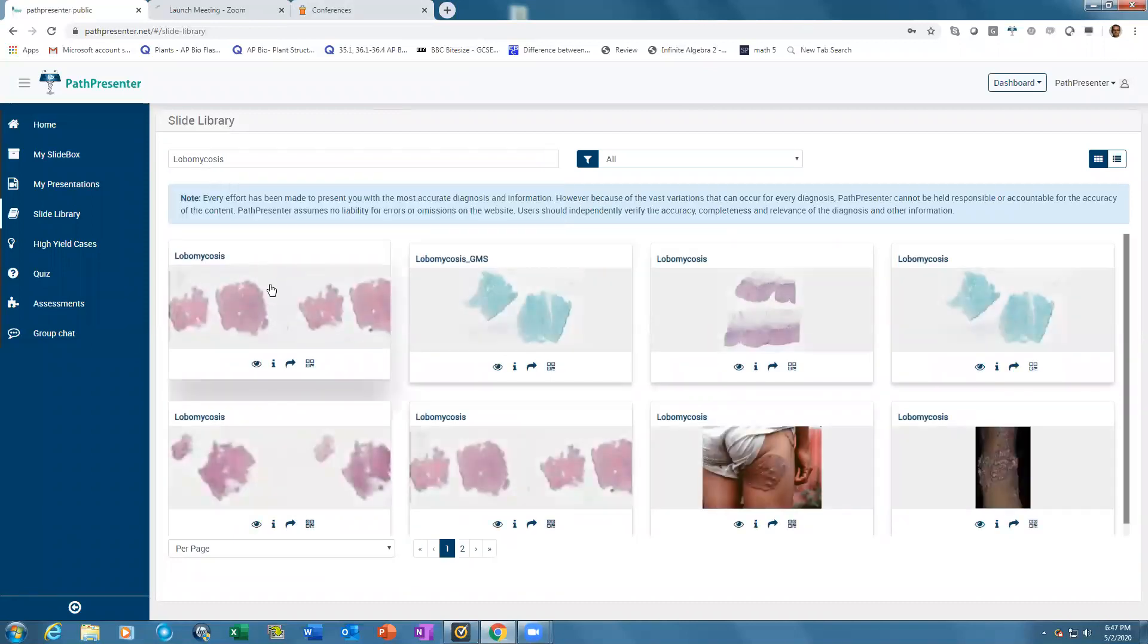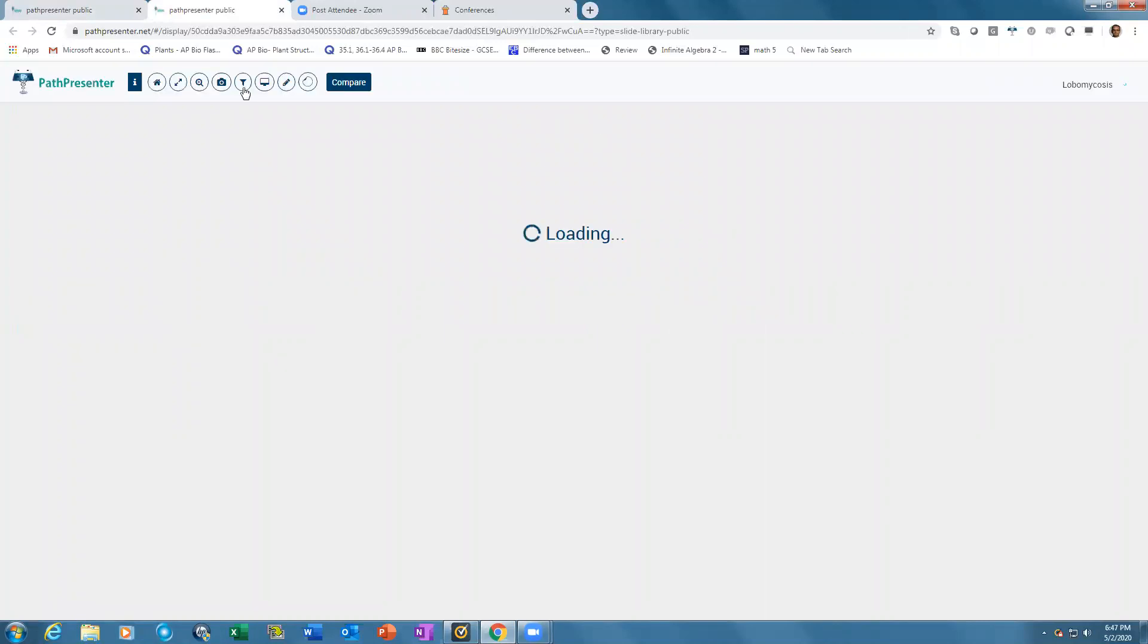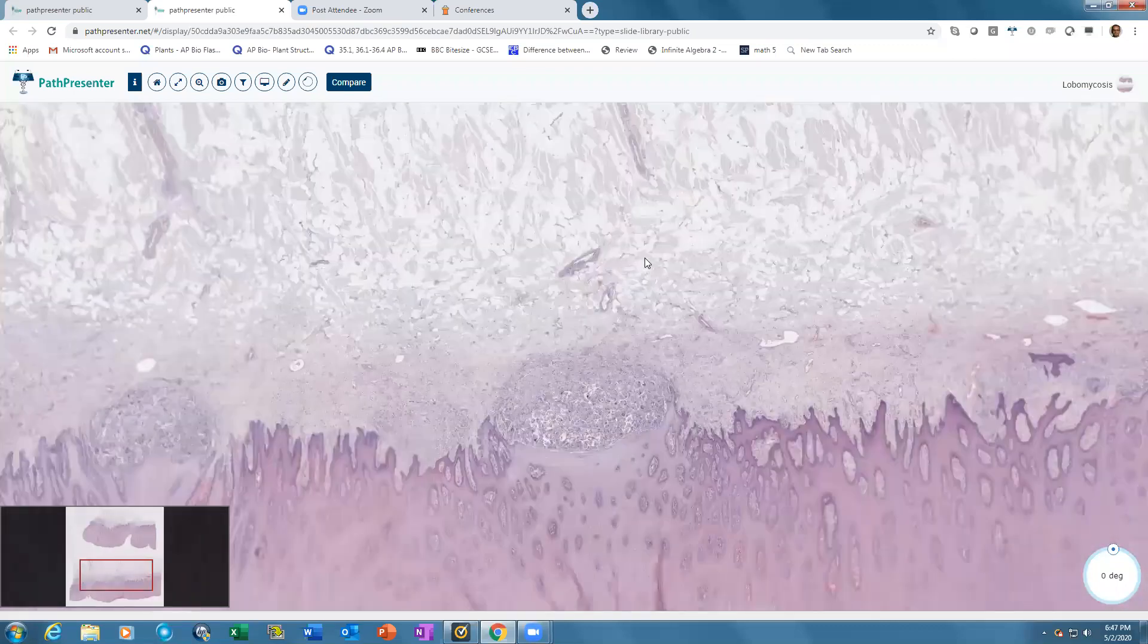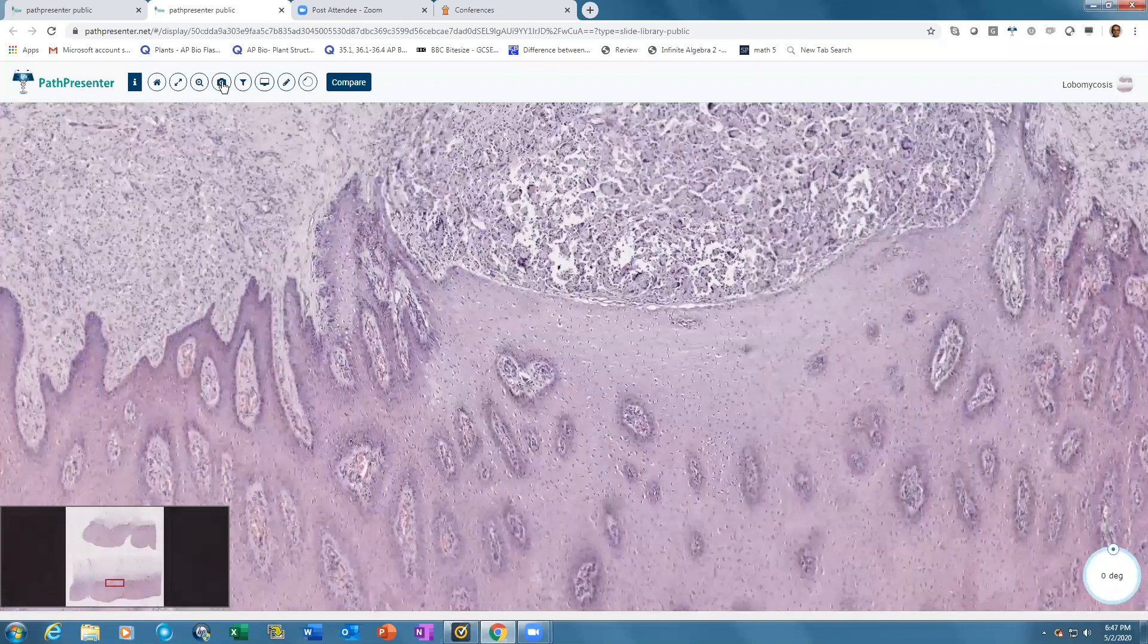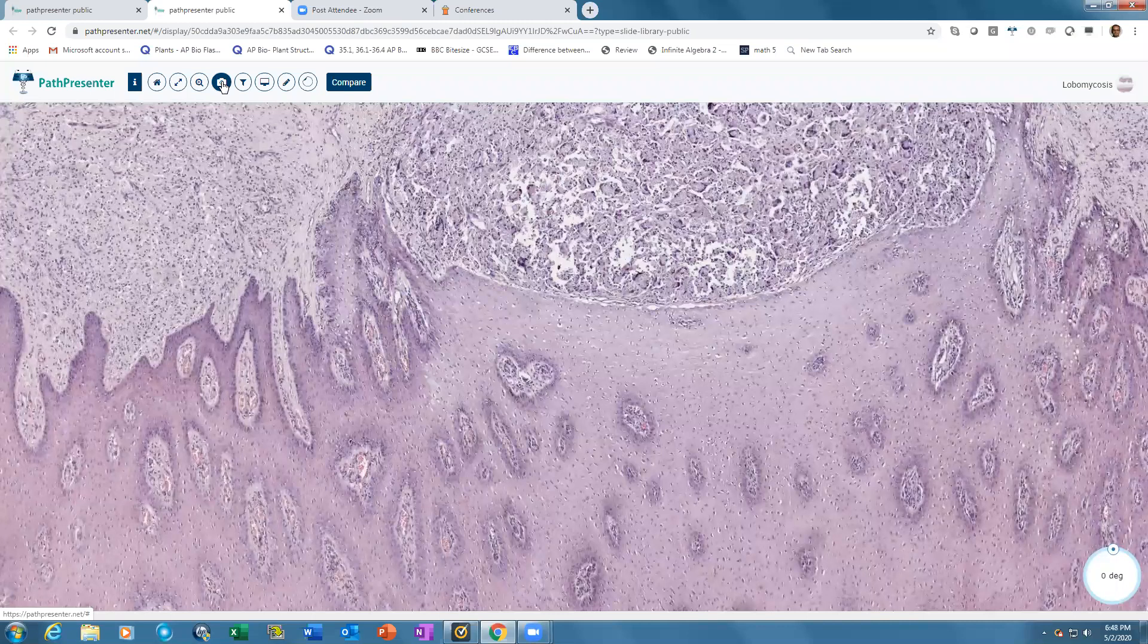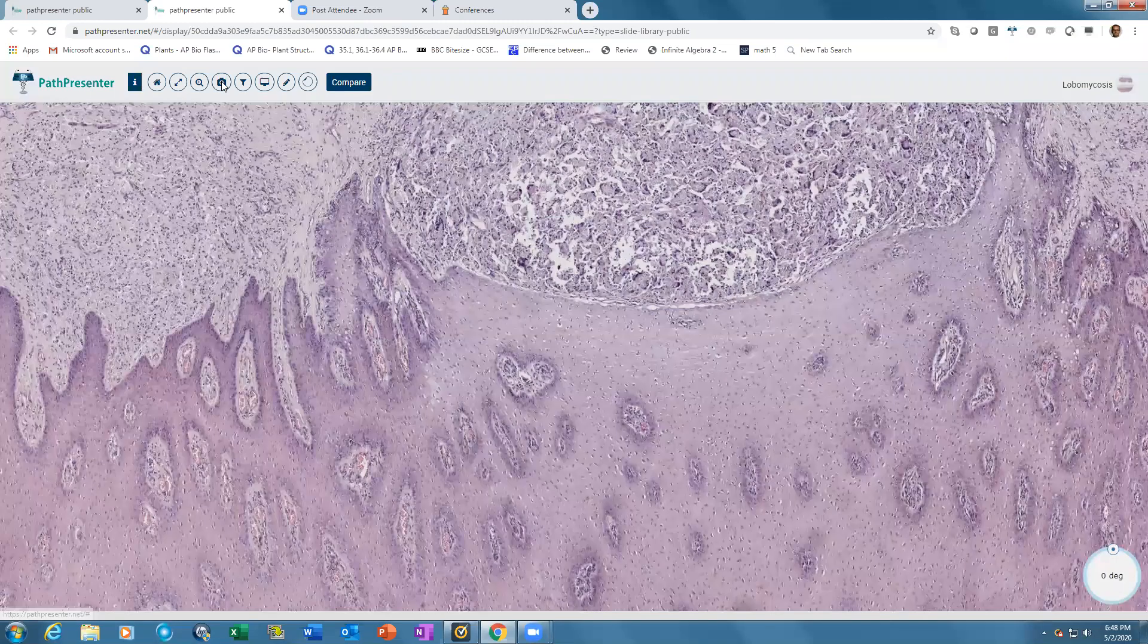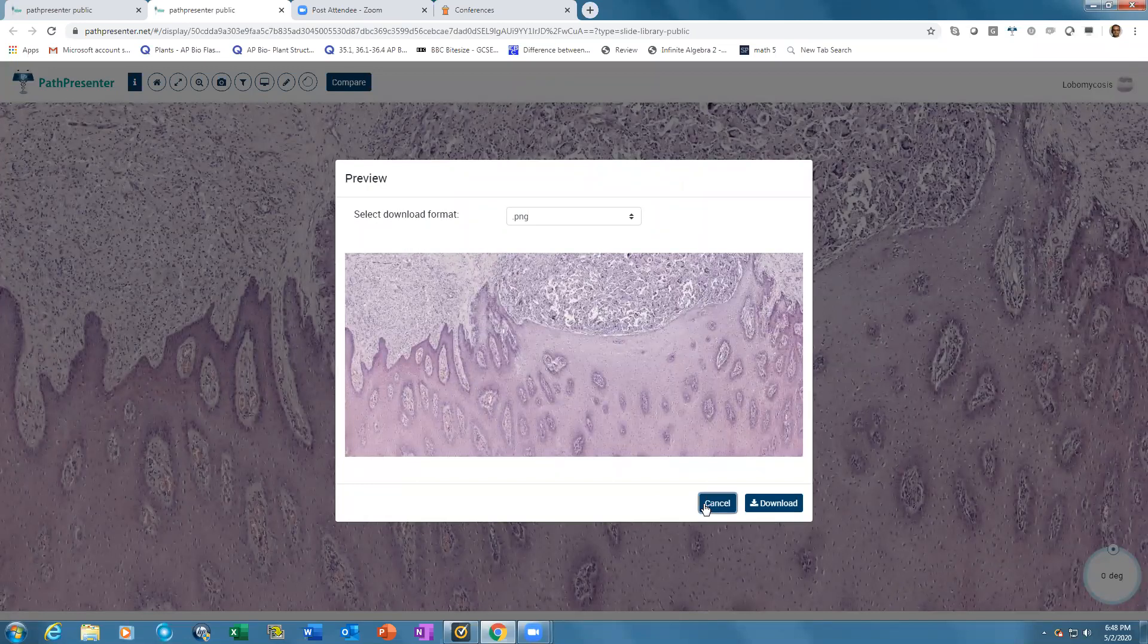You can see the slide without downloading any software. Take images from slides by clicking the camera icon on top. Zoom into the slide and click the camera icon to take a snapshot of your screen that you can use for presentations or publications.